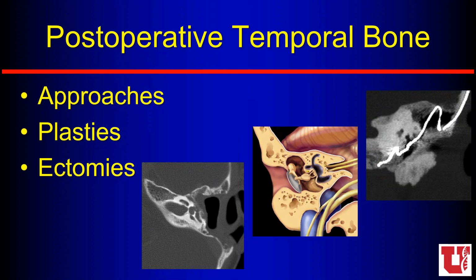So that is an approach I try to use to think logically about postoperative temporal bone cases, to help me evaluate them and get through those evaluations.